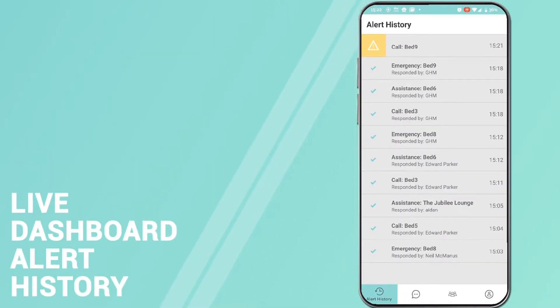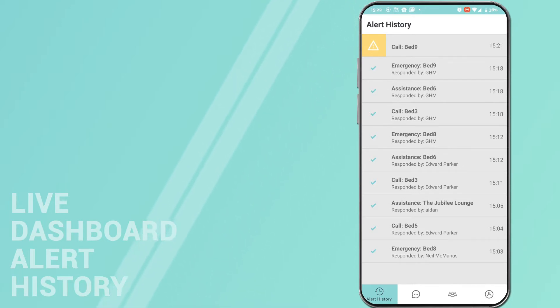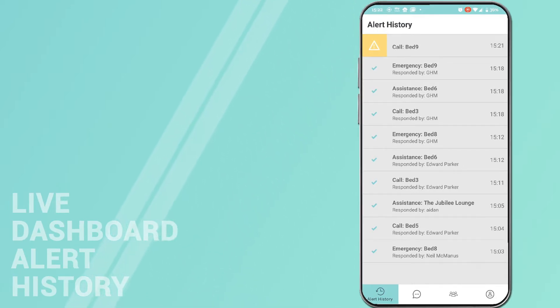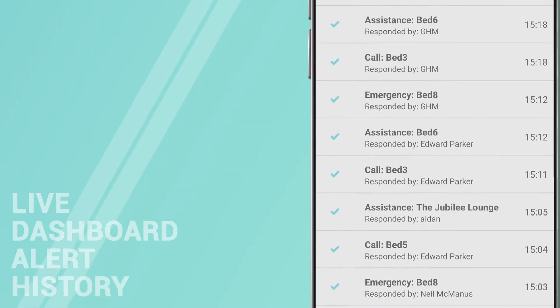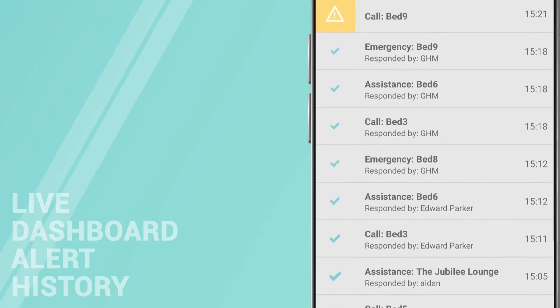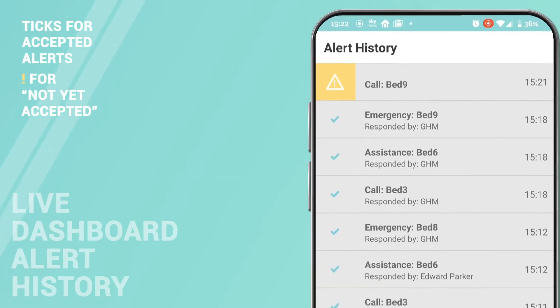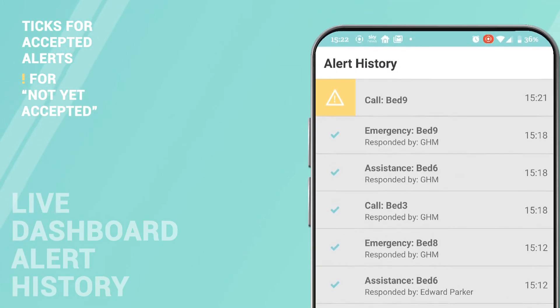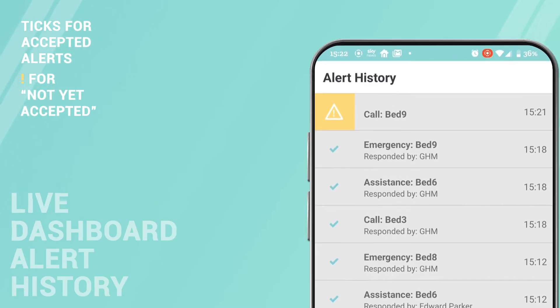The home screen will show you a live dashboard and alert history. Here you'll see all alerts from the last hour along with their location and status. Accepted alerts will show a tick and who responded. Alerts not yet accepted will show an exclamation mark on the left of the alert.